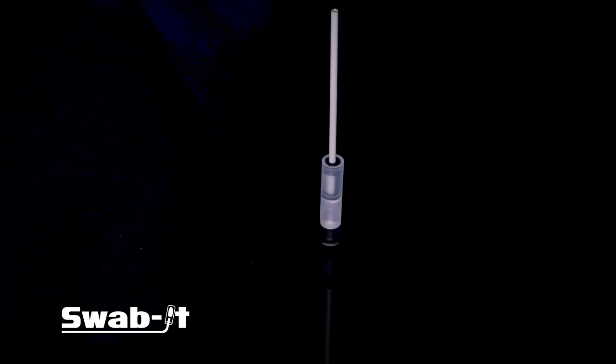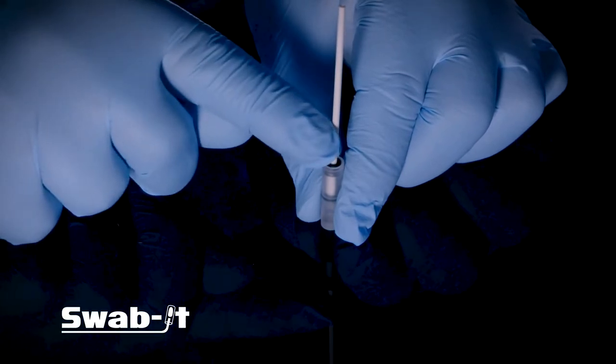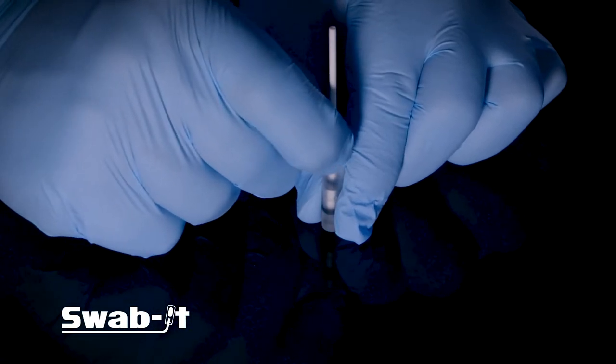Activate it at the point of use. Place the base of the ampule on a flat surface and grip the swab approximately five millimeters from the top of the ampule. This ensures full control. Apply pressure until you feel and hear a small click as the seal is broken.